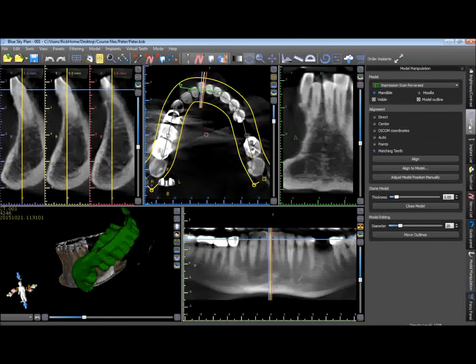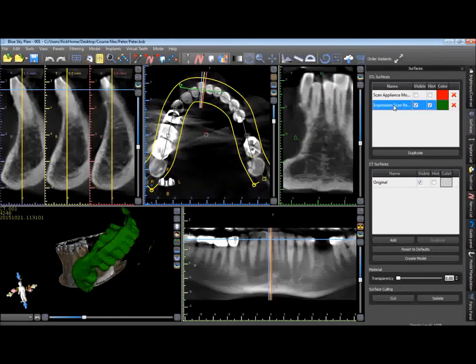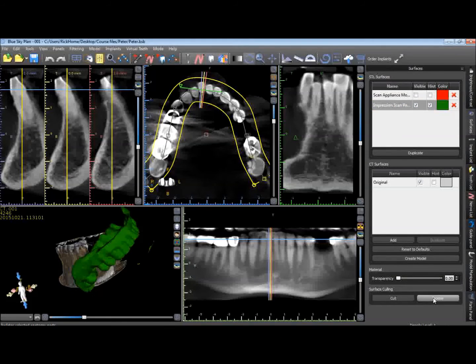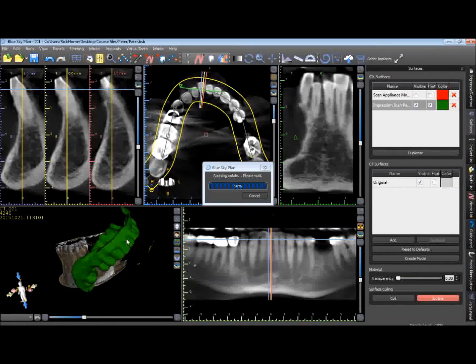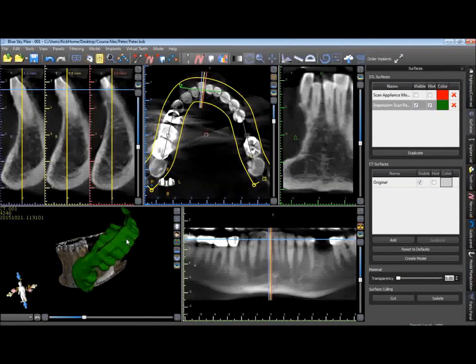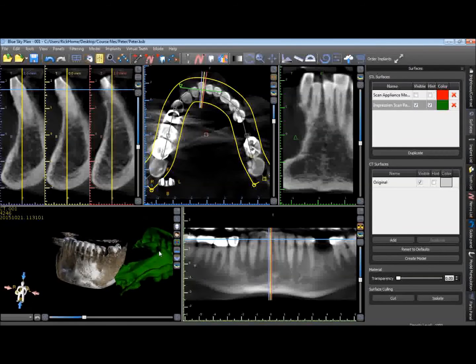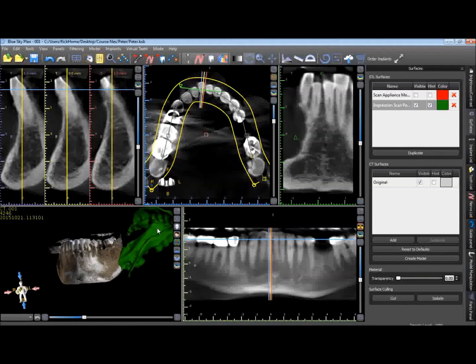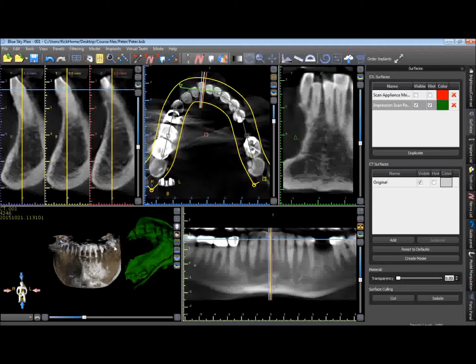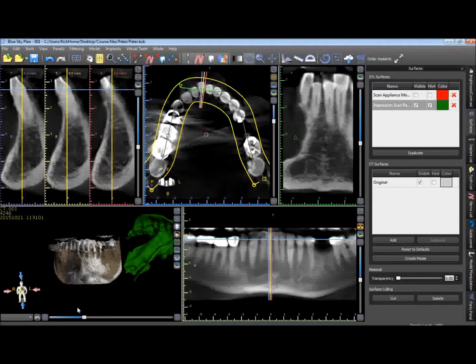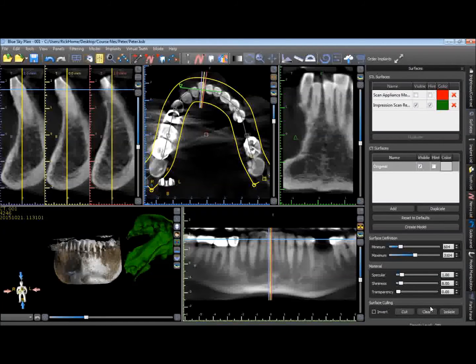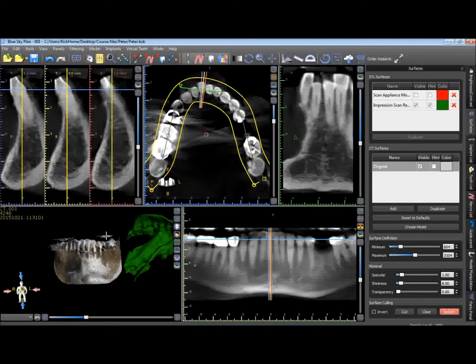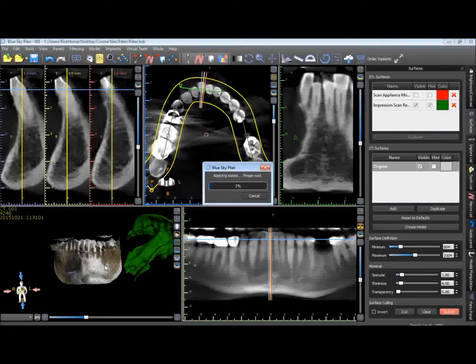And it's very easy to do by clicking surfaces, clicking on the impression scan reversed, click the isolate tool. And it will remove any areas that weren't attached to the actual impression there. We can actually do the same thing now for the jaw scan by clicking on original, isolate, and get rid of these areas of the opposing dentition that can interfere with our alignment.